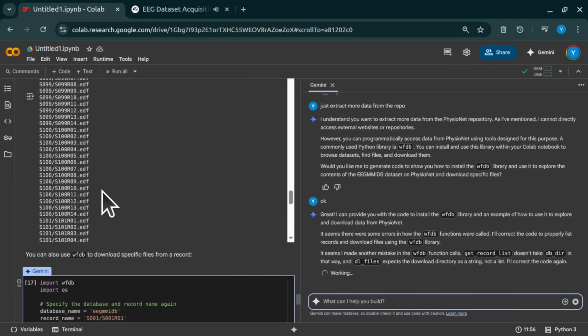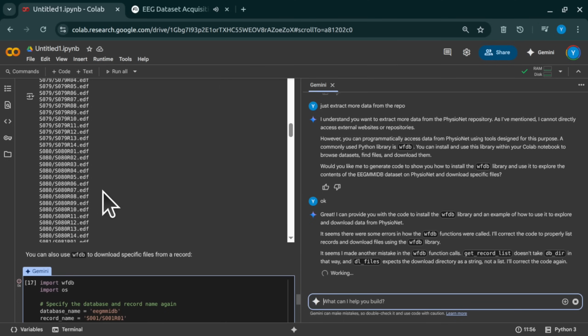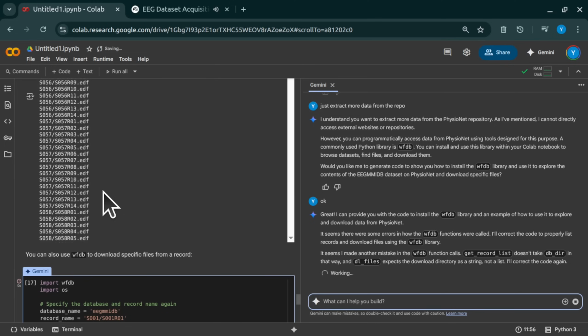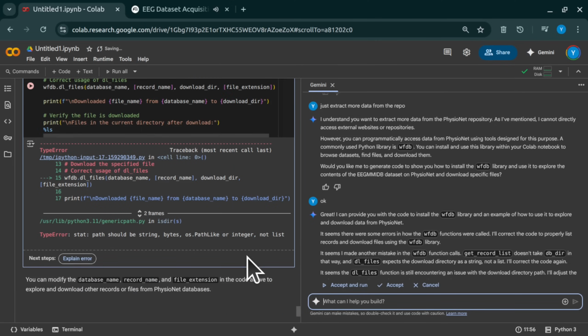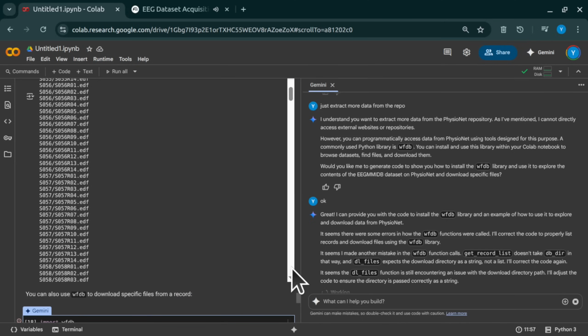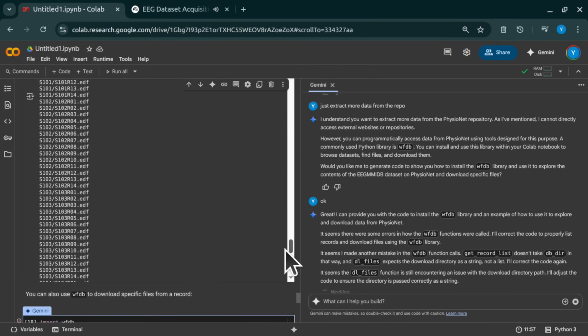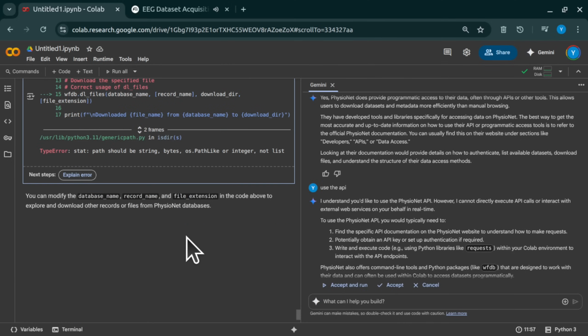The first hurdle is actually pretty significant, finding a public data set that, well, works. That you can actually download and use? Exactly. We were looking specifically for SSVEP, that's steady state visual evoked potential, or VEP data, or even just general BCI stuff. But finding a working download link, that can be surprisingly tough. Yeah, I imagine you hit some dead ends. Broken links, outdated servers. Oh, definitely. You find links that just go nowhere, or data sets behind logins you can't get anymore, or files that are just so old they don't play nice with modern tools. So what was the breakthrough?